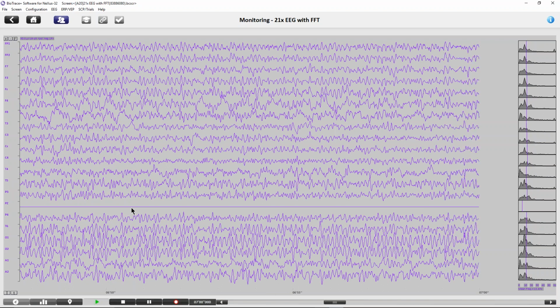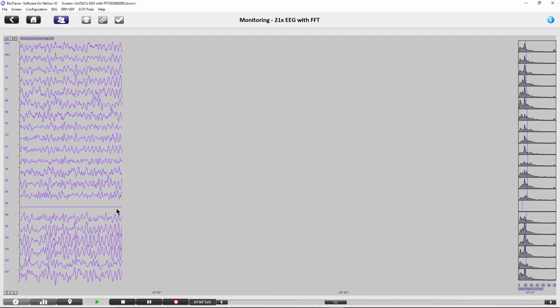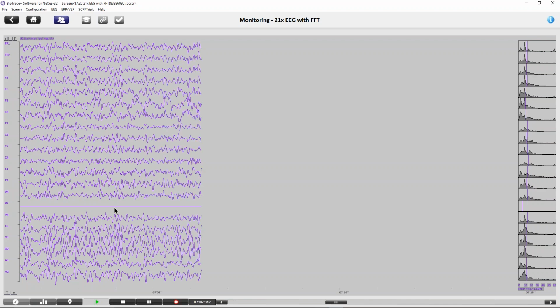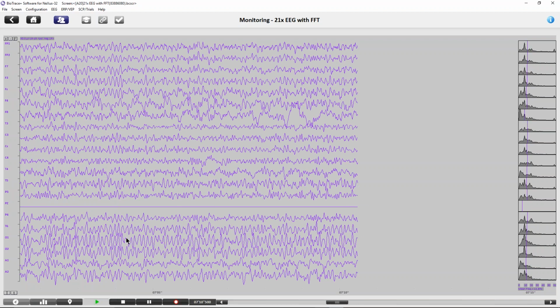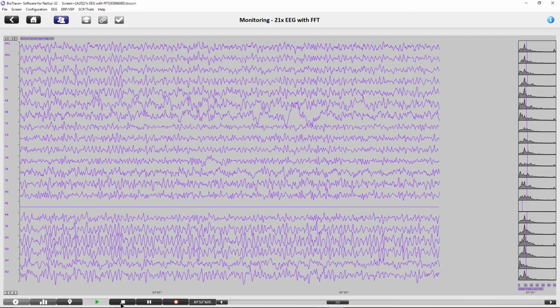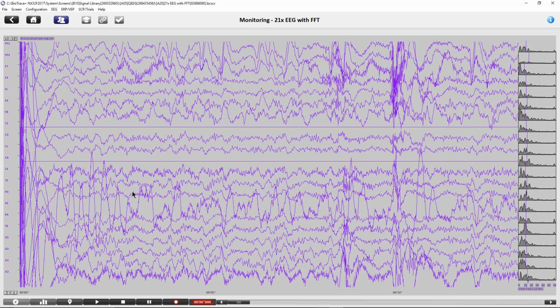To some extent, this is a good montage to use when recording, because then you get to see each individual electrode without the contribution from another electrode. So since that's a bad recording and we're not going to use it, we need to look at a different recording.